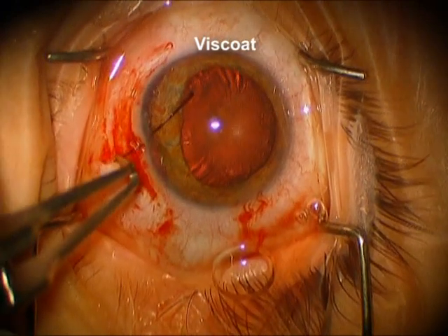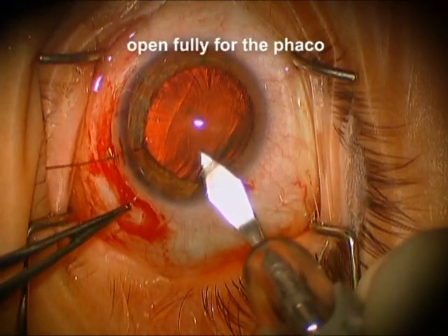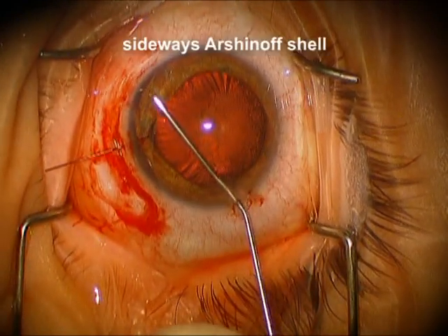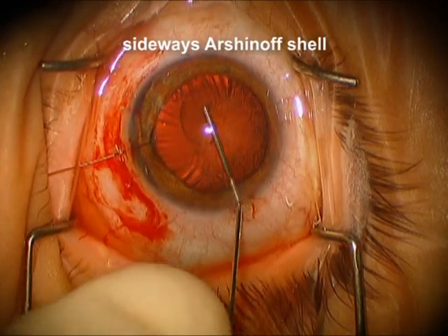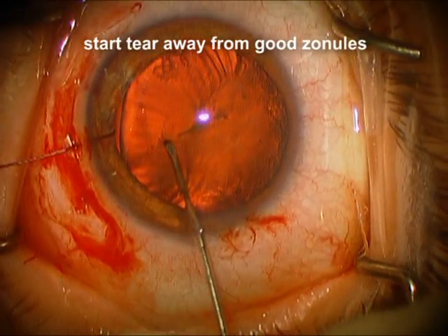We're going to initially place this iris hook onto the iris to pull back, to keep the iris out of the way in the area of the iridodialysis, opening the incision fully with the 3.0 millimeter keratome. Now we're going to do a sideways Arshinoff shell where we first put some Viscoat in the area of the weak zonules and then place the cohesive to force that Viscoat over in the area of the weak zonules.